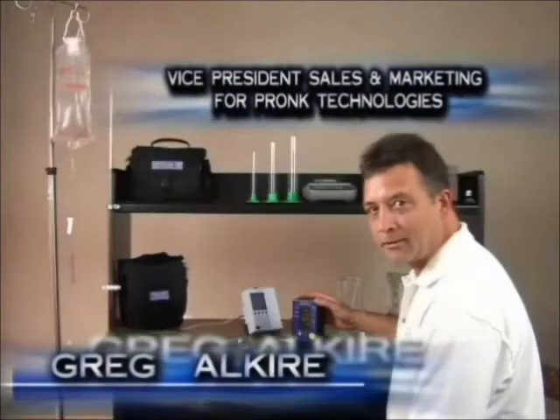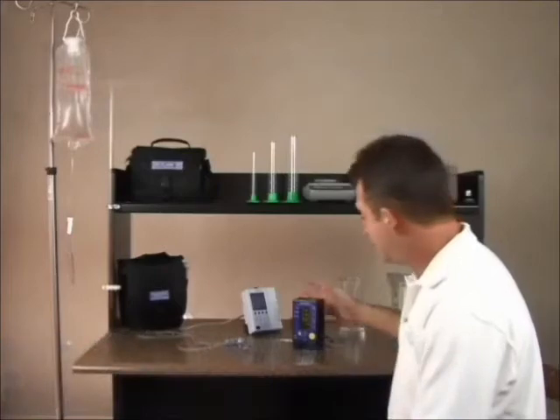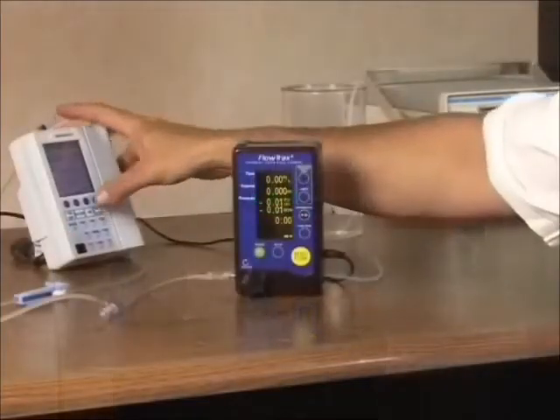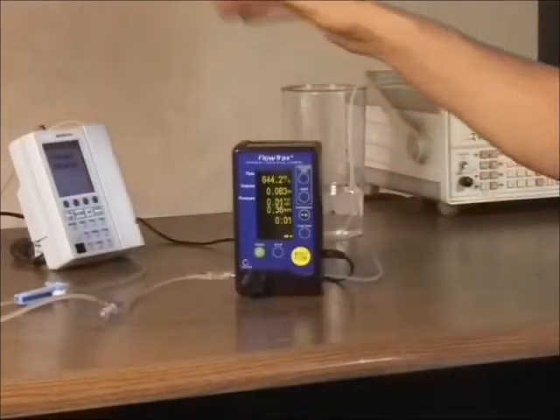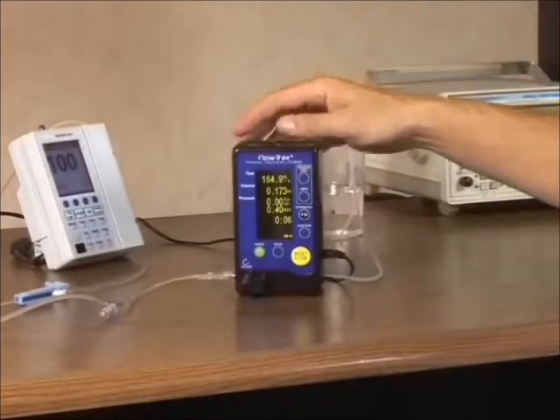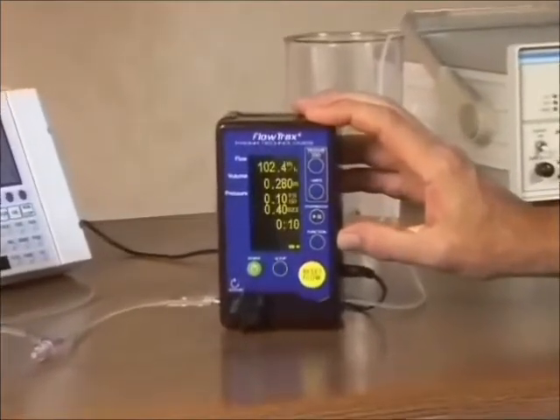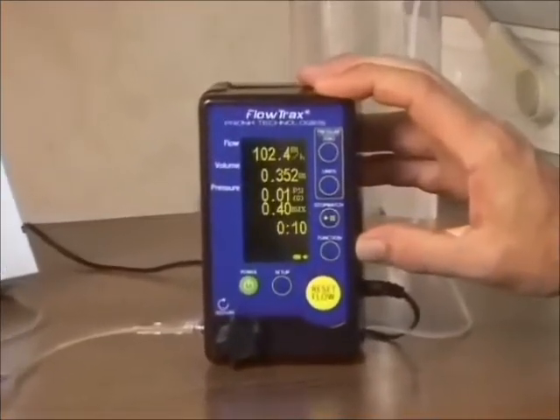Hi, I'm Greg Alkire with Pronk Technologies, and I'd like to introduce you to the Flowtrax IV Pump Analyzer. The Flowtrax IV Pump Analyzer is capable of measuring flow and volume from the IV pump with 1% accuracy, from 1 milliliter per hour to 1,000 milliliters per hour.